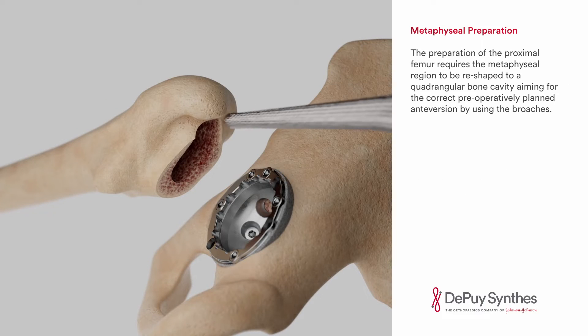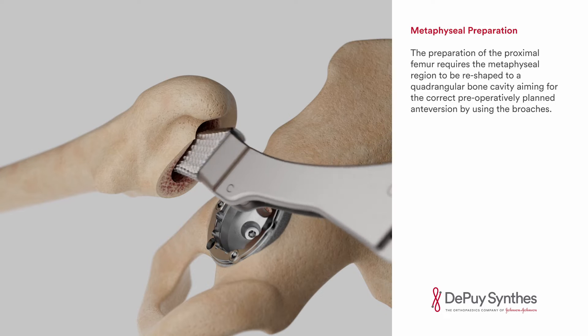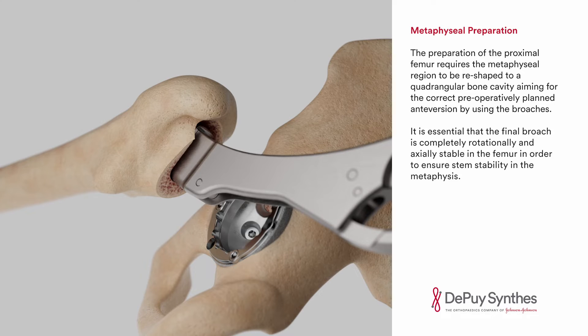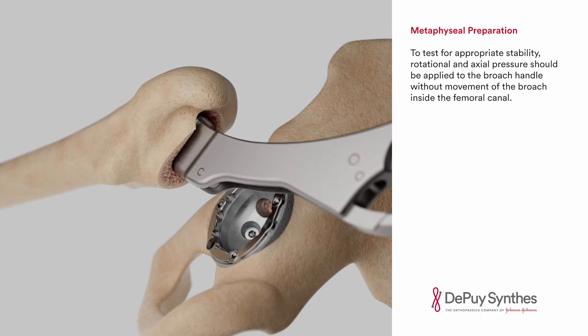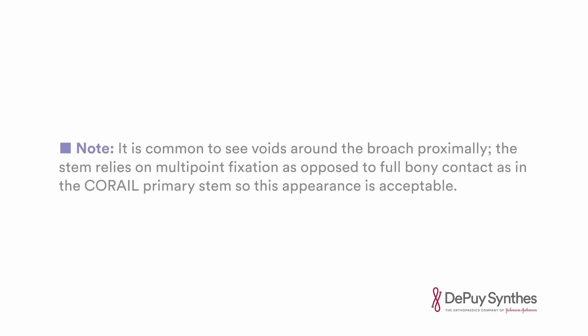The preparation of the proximal femur requires the metaphyseal region to be reshaped to a quadrangular bone cavity, aiming for the correct preoperatively planned anteversion by using the broaches. It is essential that the final broach is completely rotationally and axially stable in the femur in order to ensure stem stability in the metaphysis. To test for appropriate stability, rotational and axial pressure should be applied to the broach handle without movement of the broach inside the femoral canal. Distal stem stability alone is not sufficient. Note that it is common to see voids around the broach proximally; the stem relies on multipoint fixation as opposed to full bony contact, as in the CORAIL primary stem, so this appearance is acceptable.